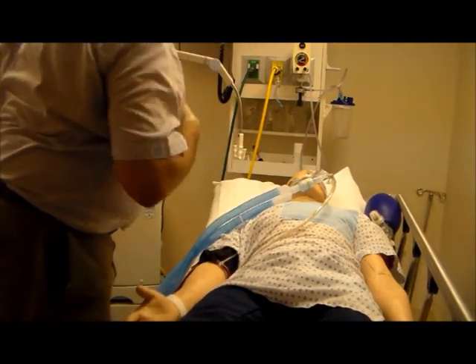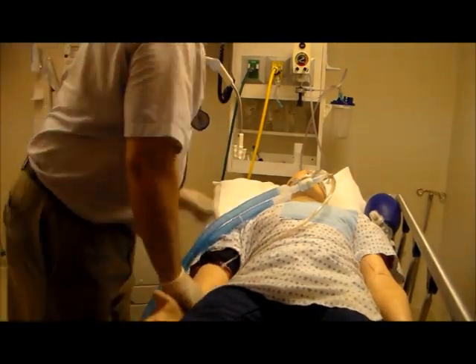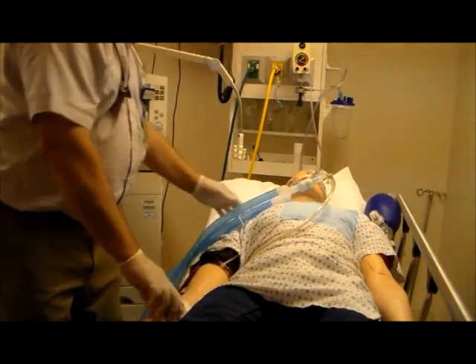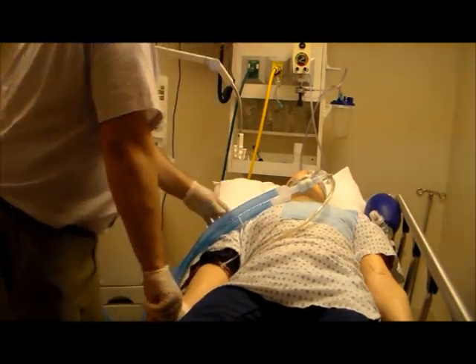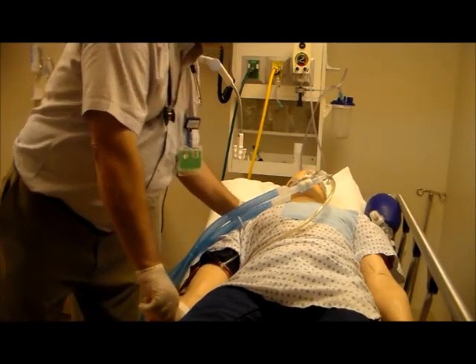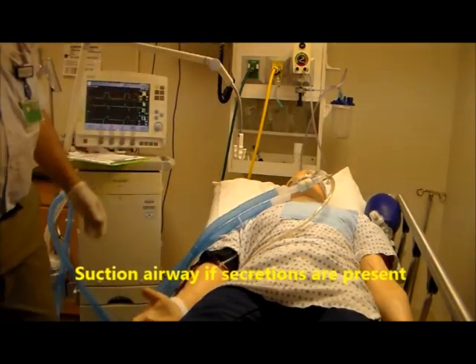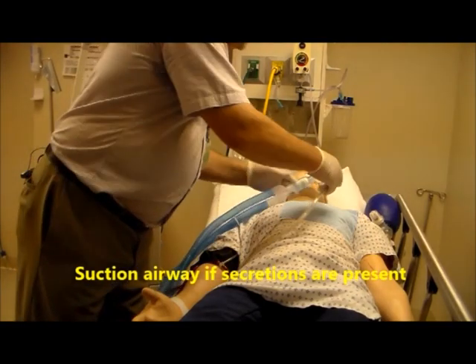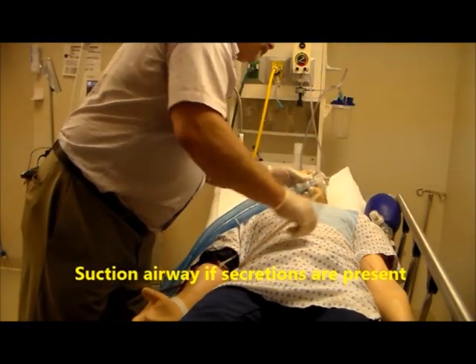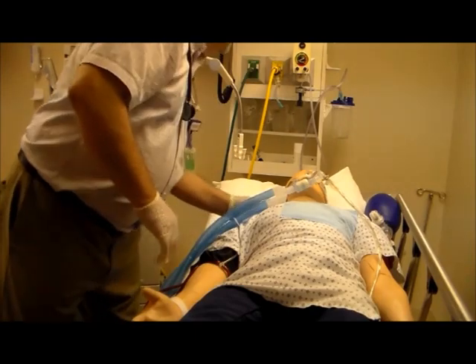I hear some wheezes, and the monitor shows us your heart rate, your saturation, and your respiratory rate. At this point you want to make sure you suction the airway if it is indicated. I don't hear any secretions down there, so I'm not going to do any suctioning at this point.